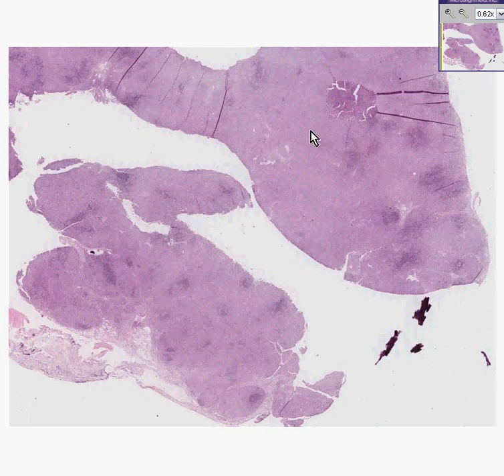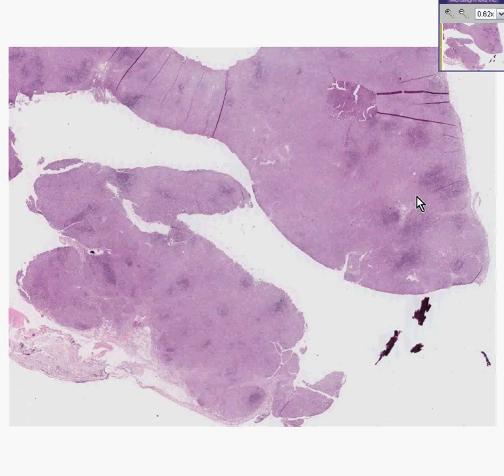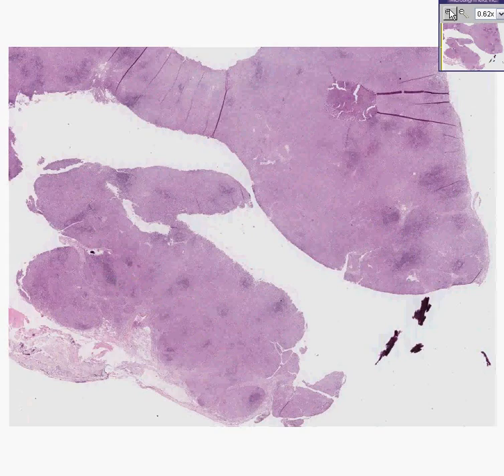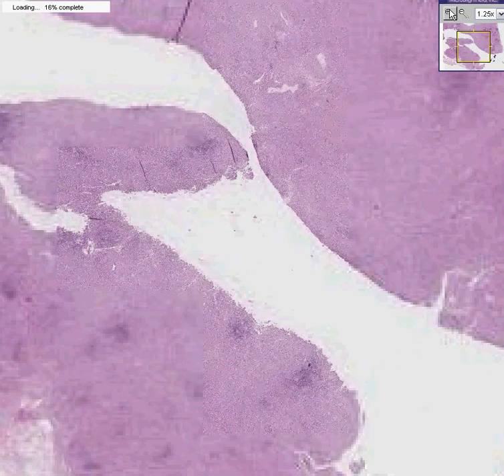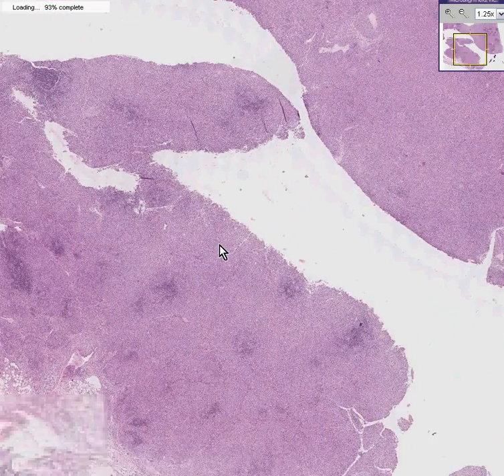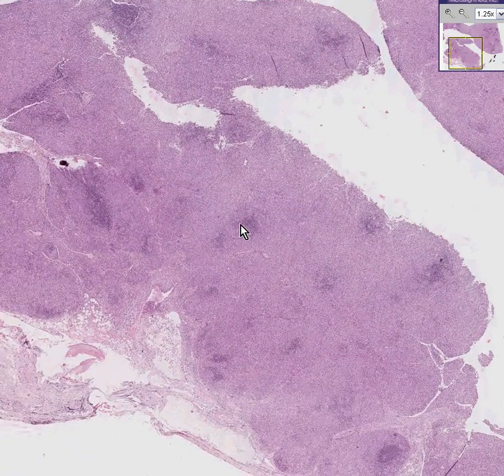Here is another case in which you see lymphoid-looking tissue. In about 10 or 20 percent of this area, you can see areas which look like clusters of small, more well-differentiated lymphocytes.